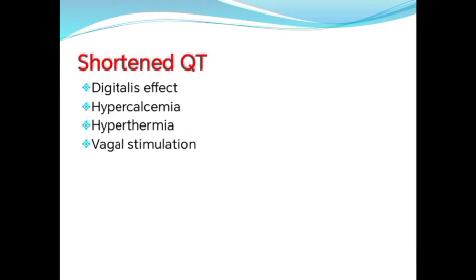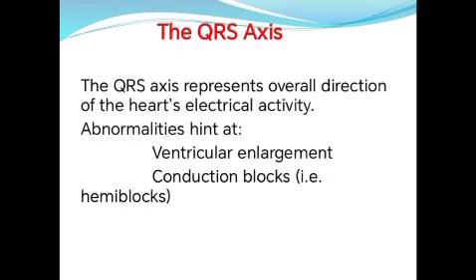So, shortened QT interval occurs in digitalis effect, such as digoxin, maybe hypercalcemia and hyperthermia, and vagal stimulation can also cause a short QT interval. Okay, you also have a congenital short QT interval.